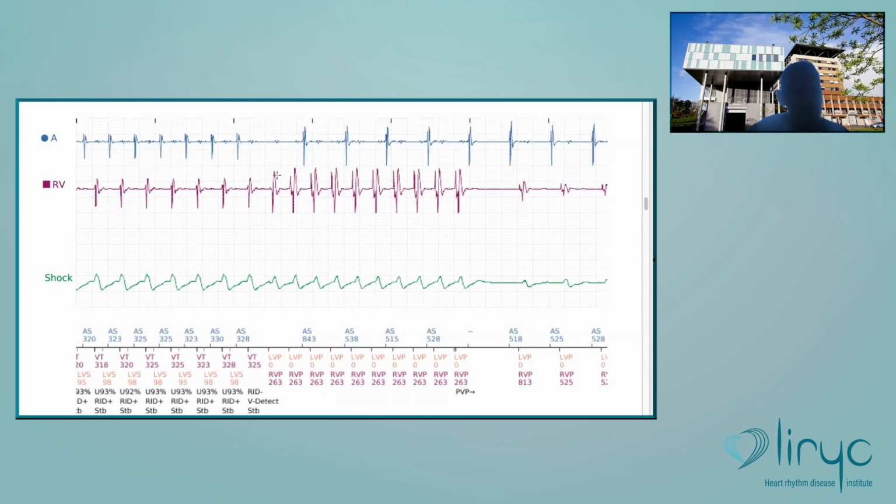And sometimes remember that if you treat with an ATP, atrial tachycardia that just started, there is quite a high chance that if it's a one-on-one tachycardia, it means that there is a good transmission from the atria to the ventricle. Another possibility is that you also have a good transmission from the ventricle to the atrium, and then you may reduce some episodes of atrial tachycardia with a ventricular burst.